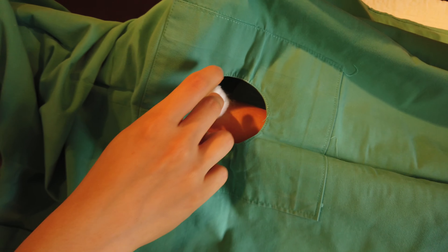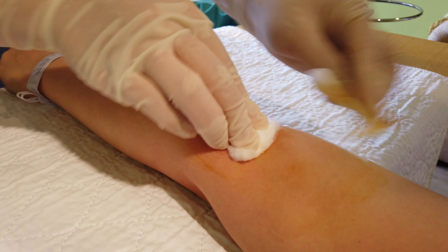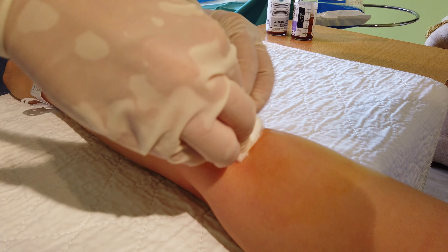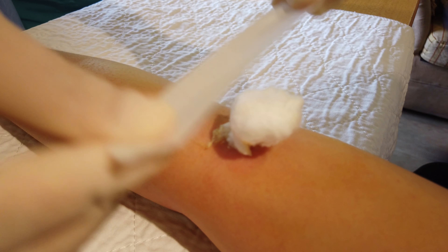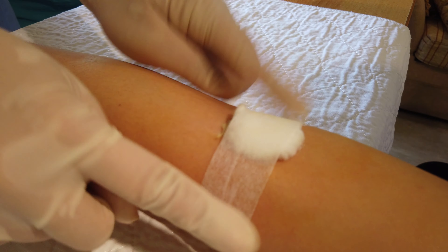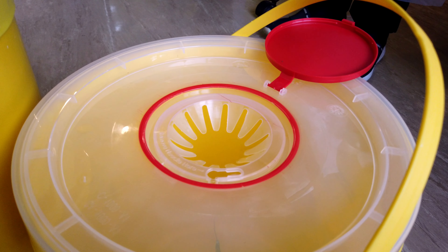Post procedure, ensure that there is no uncontrolled bleeding. You may clean off the povidone iodine on the patient's skin with alcohol, then secure the cotton swab with a micropore or plaster. Ensure that all sharps are disposed into the sharps bin.